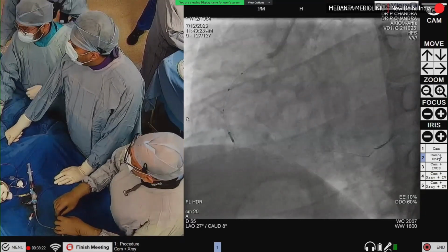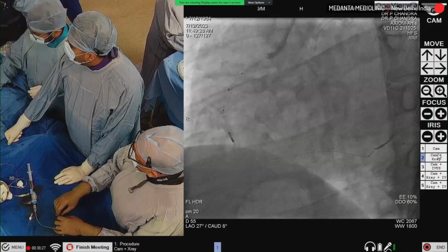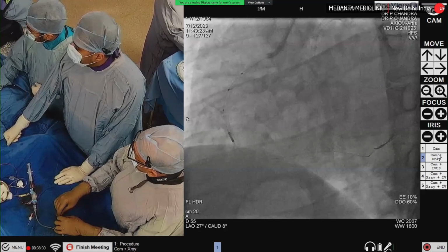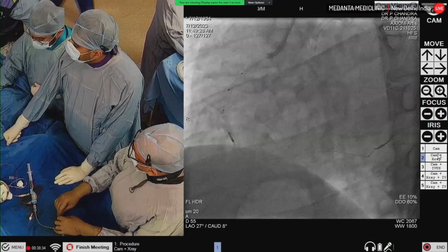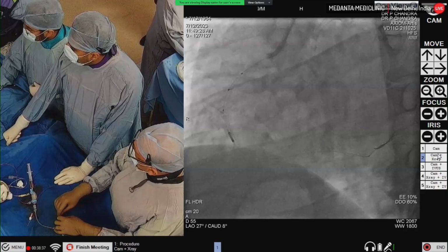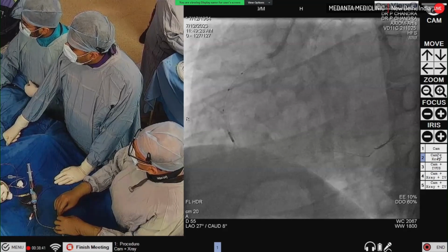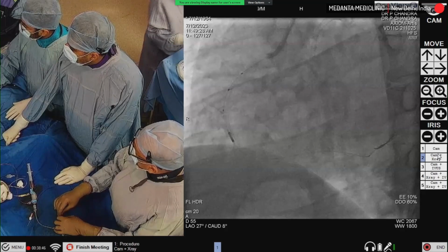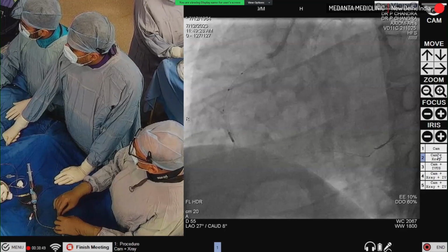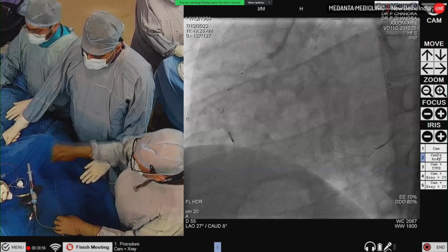Okay, live. Check. Live. On. Yeah, so just beyond, this is beyond the 3.5 stented segment. I'm pulling back. Yeah, I think we need to expand it with a 3.5, because I can see that the vessel has grown now. But of course, the lumen is looking good still, and there is the proximal edge, and fine. Okay, stop.